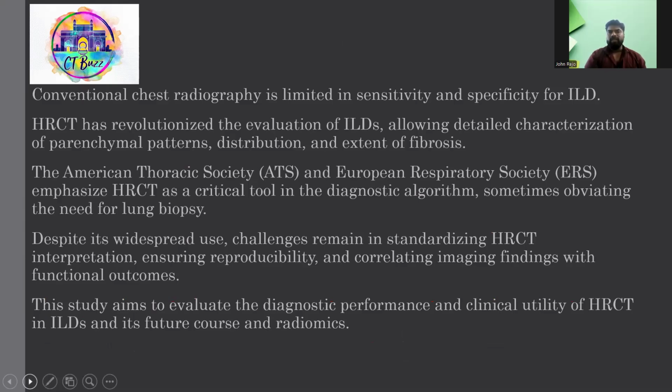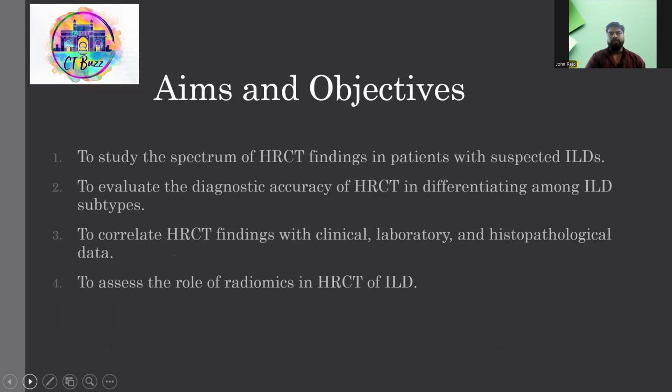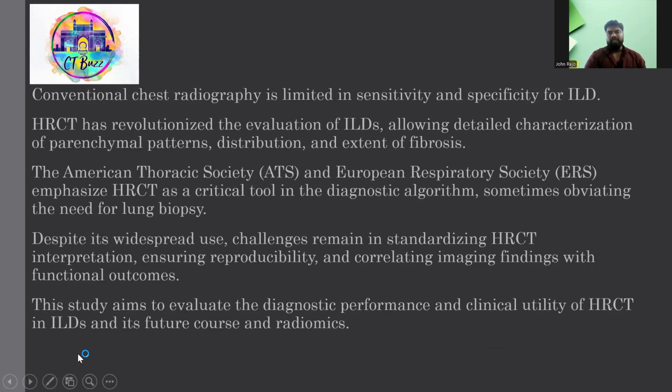Conventional chest radiography is limited in sensitivity and specificity for ILD. HRCT has revolutionized the evaluation of ILDs, allowing detailed characterization. The ATS and ERS emphasize HRCT as a critical tool in the diagnostic algorithm. The study aims to evaluate the diagnostic performance and clinical utility of HRCT in ILDs and its future course and radiomics.